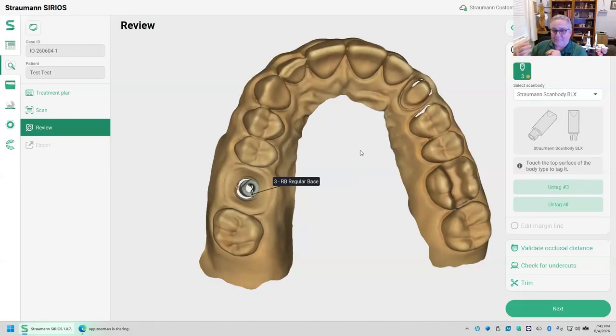No, your lab took care of that, okay? And today, in the world of digital impressions, the vast majority of implants scanned, the scan body is validated in the laboratory, okay? But this being a Straumann scanner with Straumann software, Straumann offers an optional feature for when you are scanning Straumann implants to move that validation a step closer to the patient and having you validate chairside. The only thing that does is eliminate that very small possibility that the lab would say, hey, we can't see your scan body properly enough. You need to rescan your patient.